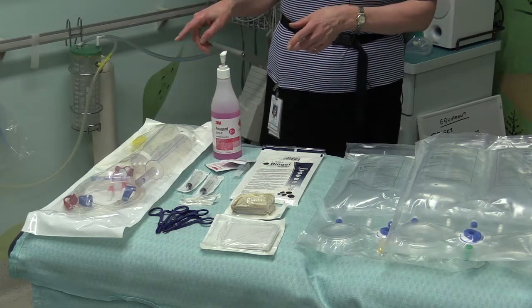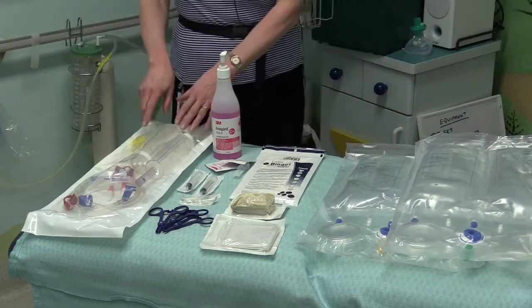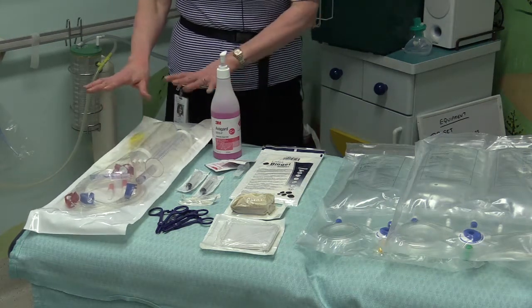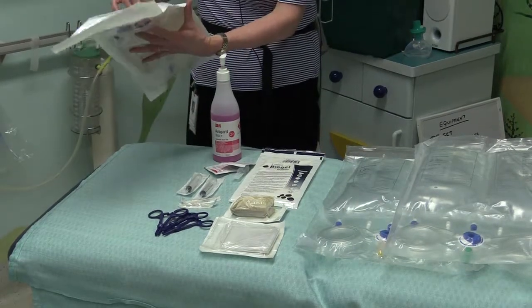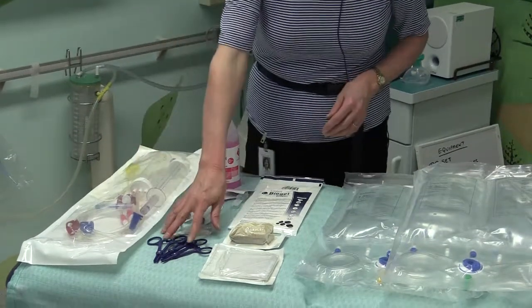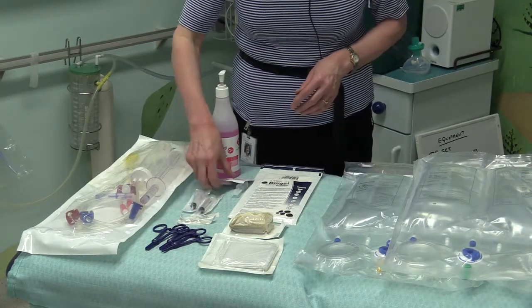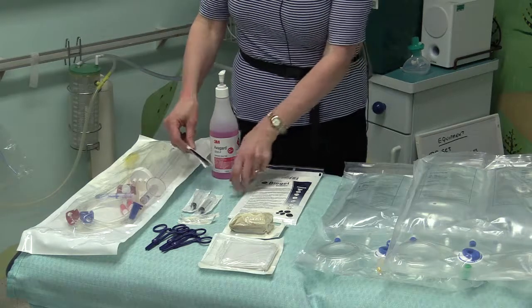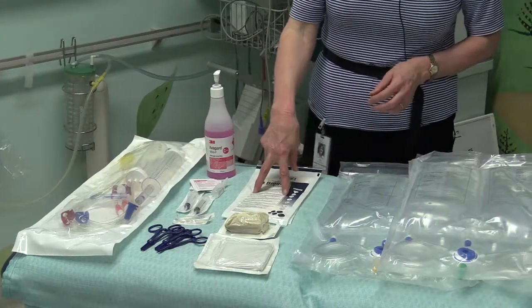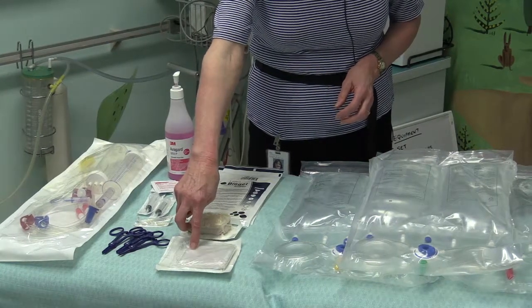I'll start by going through the equipment that's in the pack that will be provided for dialysis. Starting off with the peritoneal dialysis set, which must be undamaged, so you should check the package that it hasn't been accidentally opened and there aren't any holes or damage to the package. We're going to need some clean clamps, which will also be provided, 2 needles, 2 syringes, some alcoholic wipes, because we're going to add some heparin to the fluid, a vial of heparin, some sterile gloves, a scrub brush, a sterile drape for a dressing trolley.